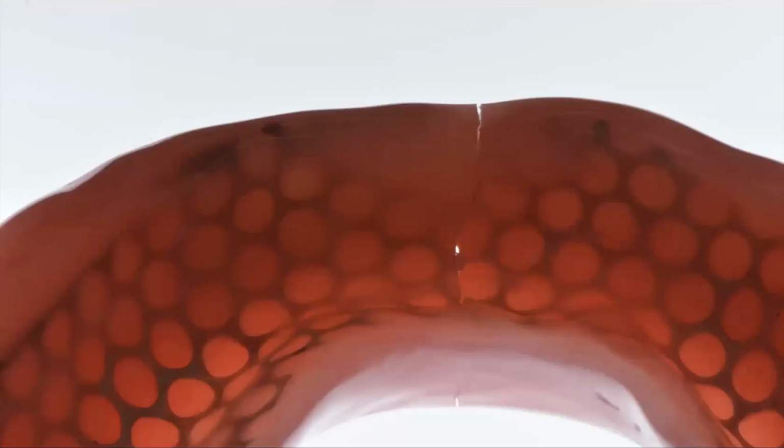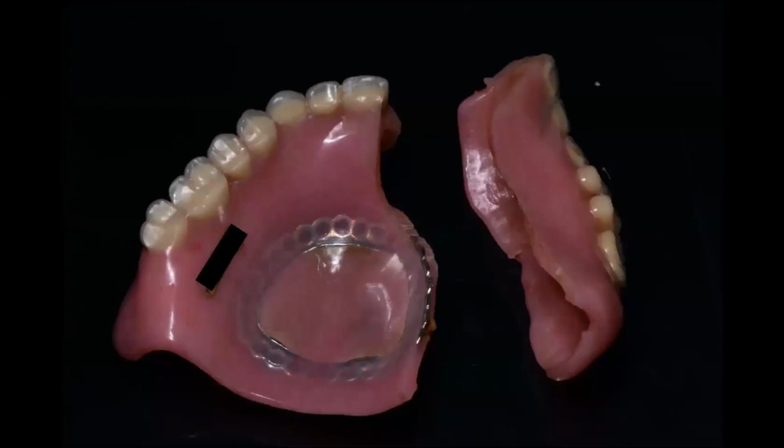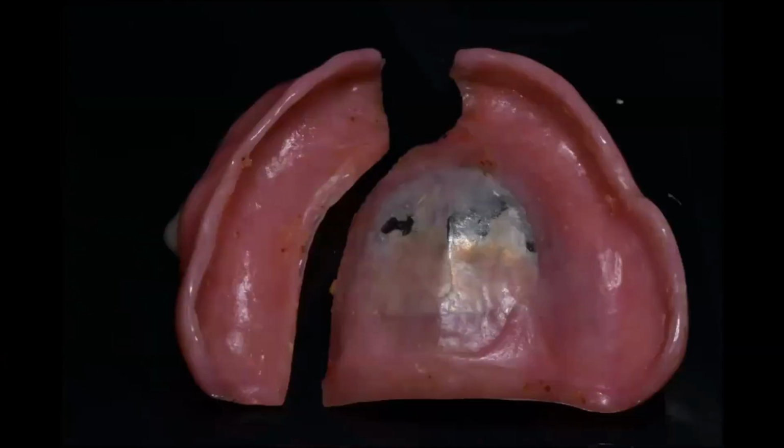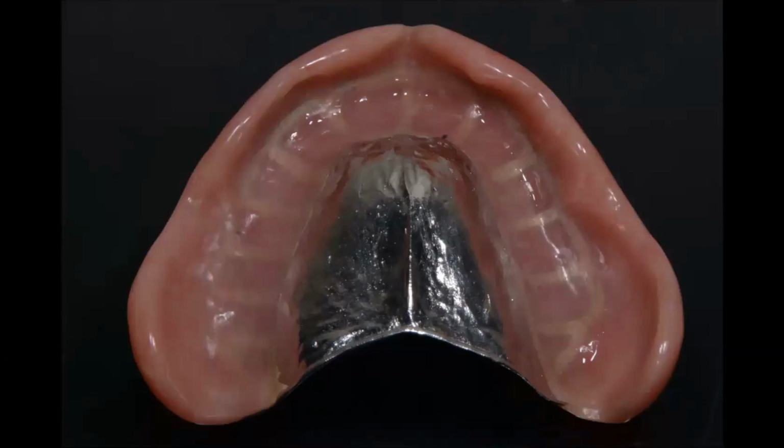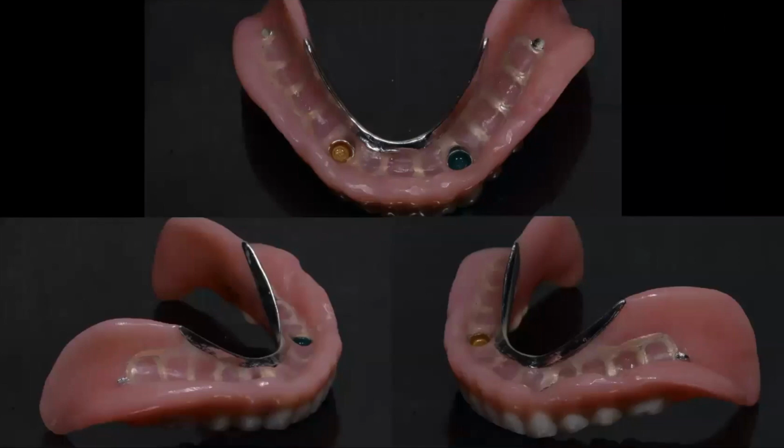In this case, the patient was a big guy with big masseters and kept breaking the dentures. So in that case, maybe going back to CAD/CAM dentures with some metal reinforcement and bulking of the dentures would be the way to go. When you do the reinforcement for the palate, even if you keep the palate, make sure your metal covers above the ridge, so you have good support. This is a good case to show. The metals are all over the ridge, so you have good reinforcement. For the mandibular arch, it's the same thing. It's a kind of RPD design, but with good metal reinforcement.